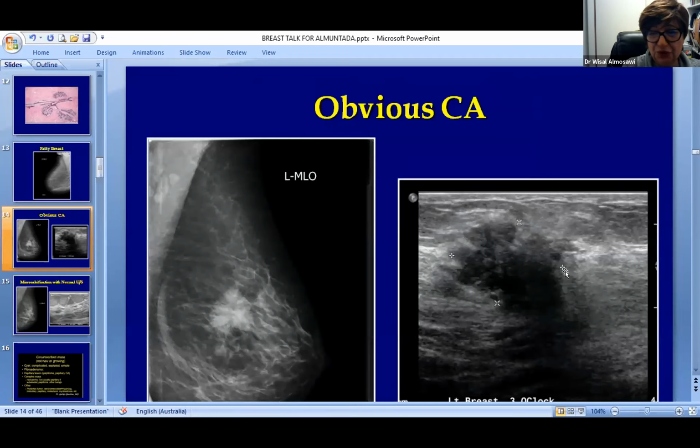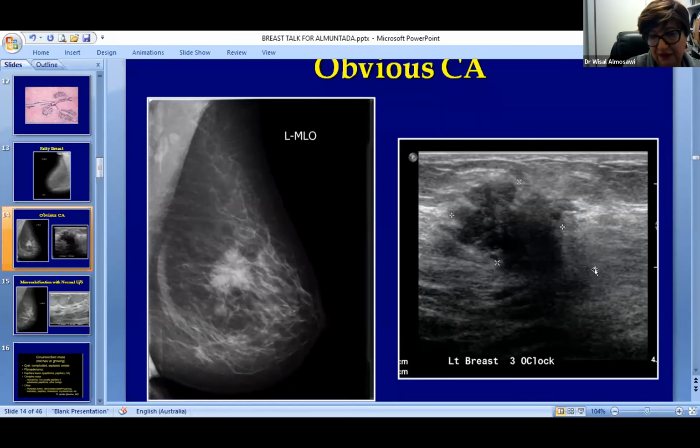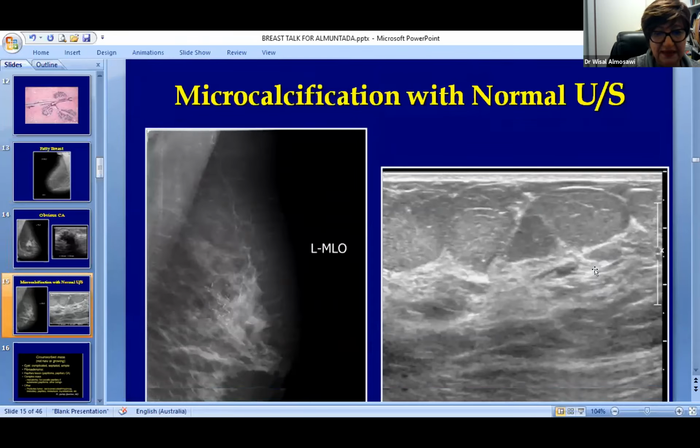I'm just going to show you a very simple, straightforward example of what breast cancer looks like. So usually it's irregular in outline, it has a spiculated margin, and it's dense. And when you compare it with ultrasound images, it's hypoechoic, height bigger than width. You see it's chewing into the breast parenchyma with spiculated margin, and it's associated with shadowing, and sometimes it has vascularity. So this is a BI-RADS type 5. So this is a different cancer.